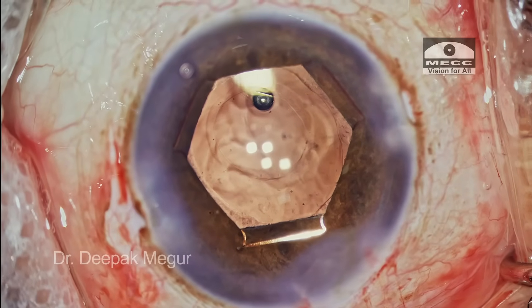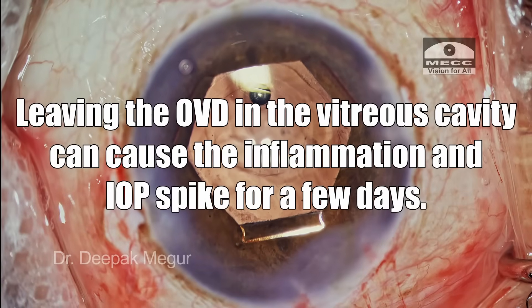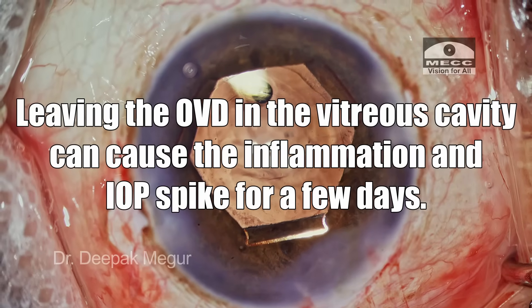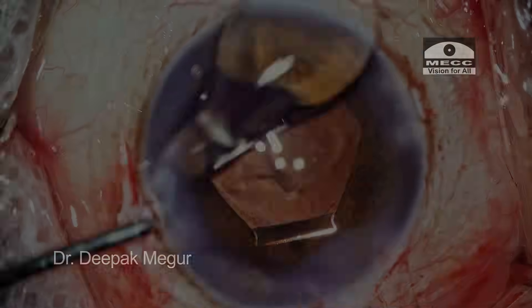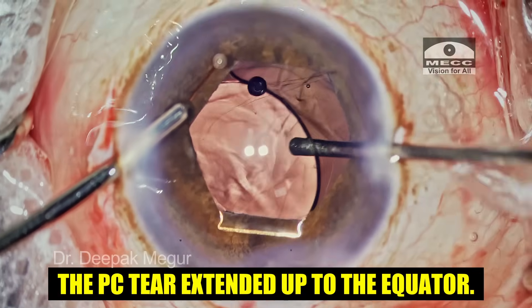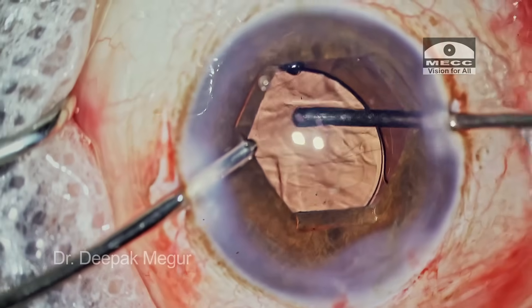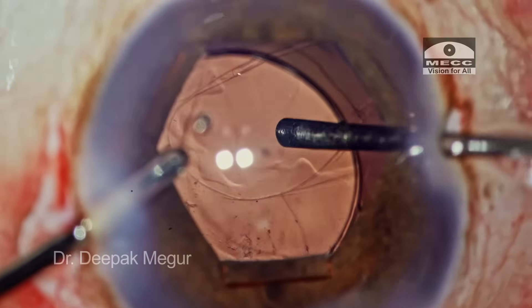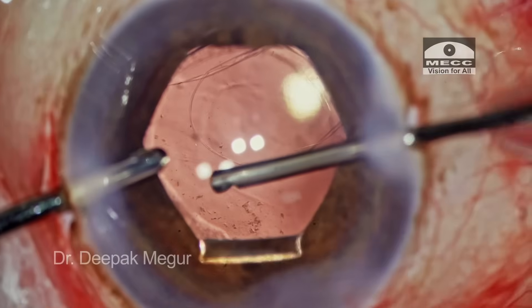I thought I could go ahead and remove the OVD behind the lens, since leaving OVD in the vitreous cavity can sometimes cause inflammation and pressure spikes in the first few days. As a custom, I go in to remove the OVD. The moment the irrigation cannula goes in and I try to lift the lens, I feel that the posterior capsule tear has extended — this was heartbreaking. I felt the rhexis was so strong it wouldn't extend, but my assumption was not good enough. Maybe there was a weak spot not visible. The posterior capsule tear extended beyond into the equator.